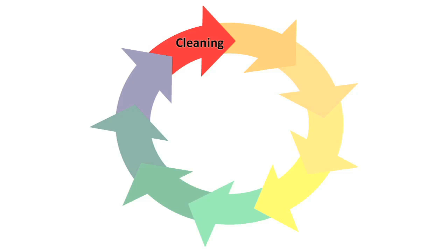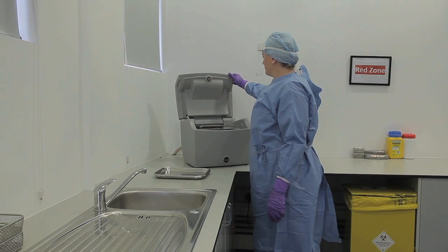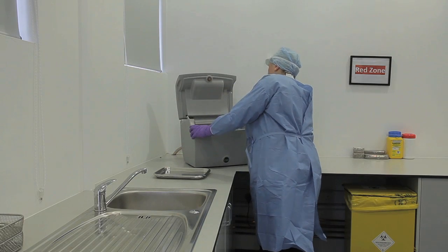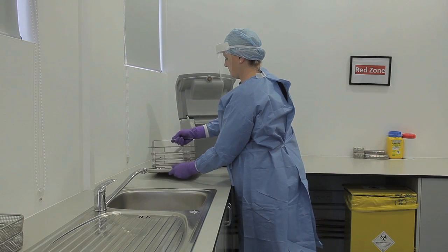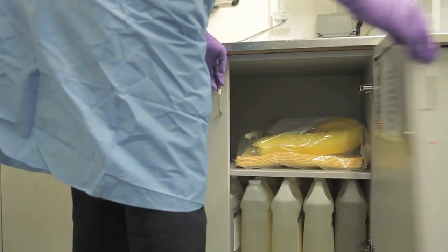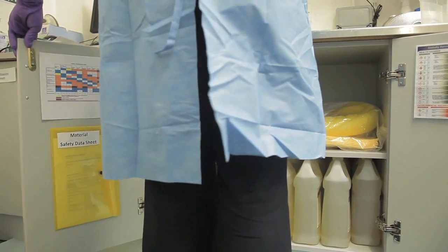The next step in the sequence of decontaminating the RIMD is Step 2, cleaning. The dental healthcare worker turns on the ultrasonic bath, closes the drainage valve, adds the appropriate measure of cleaning agent, for example detergent or enzymatic cleaner, for the machine and fills the ultrasonic bath with water. Follow manufacturer's instructions regarding the type of water and cleaning agents to be used in the ultrasonic bath.